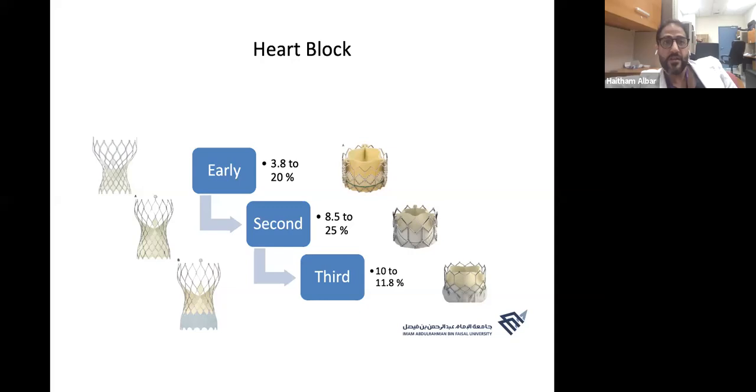The calcium is there, radial force initially, fibrosis at that area, and if you look at their profile, you find more calcium burden, especially at the area around the membranous septum. And the area is under investigation. If I were to answer this way, I would say the area is still under investigation and the data is emerging every day. This is what I would answer.